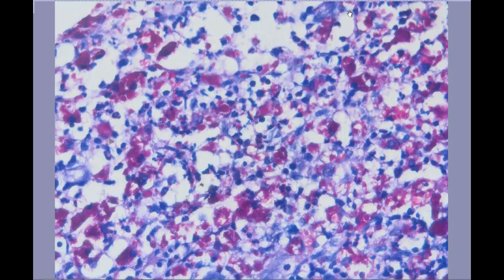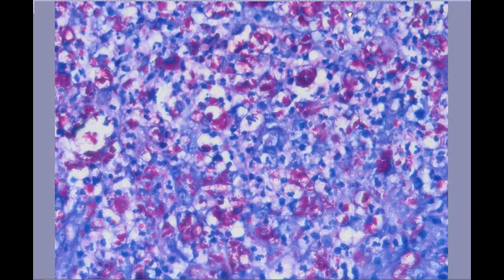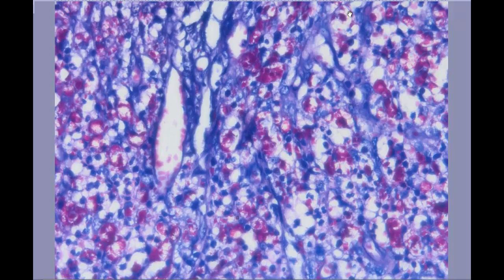And it turned out that the patient's parents were actually related, and there was a history of death of a baby cousin as well in the family, which all point to the presence of immune deficiency, which is why we saw this particular lesion, BCG-related histiocytosis after BCG vaccination.